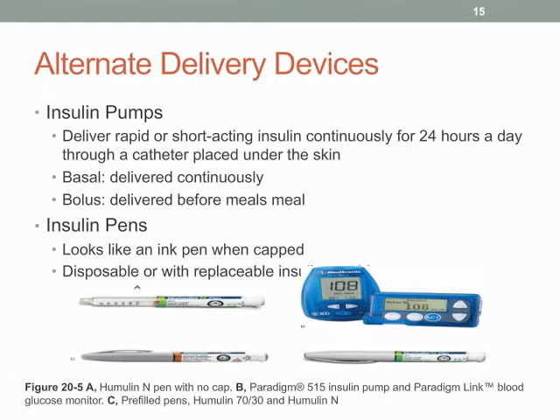The insulin pens are exactly what they look like here with the blue arrow, and they are, as I mentioned to some of you in class, there's a little dial. You dial in the dosage that the patient requires, and then they just stick themselves. There's a small retractable needle in the pen, and they can carry that around very conveniently.